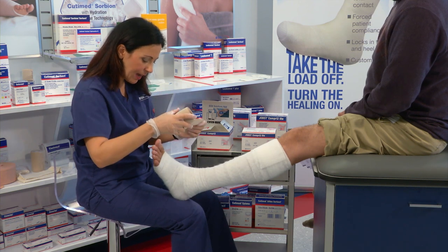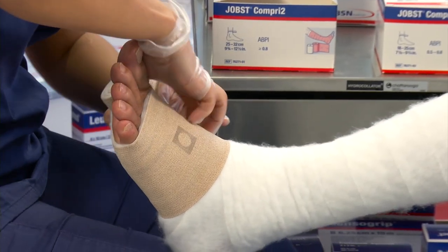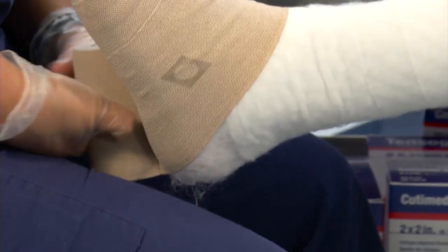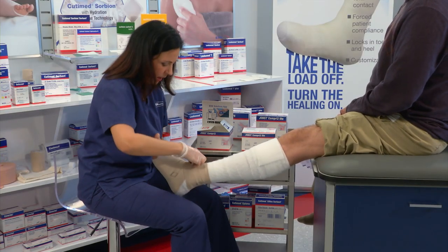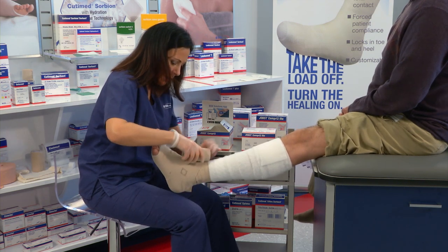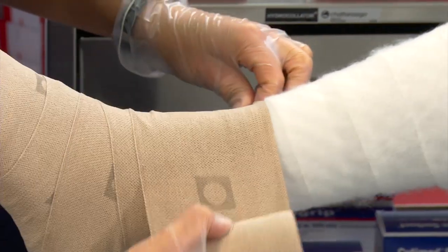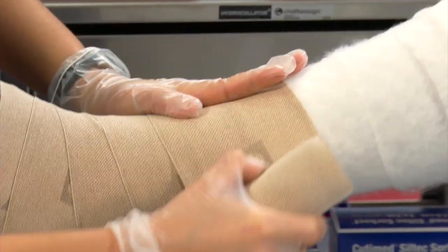We're going to apply this layer in the same fashion as we applied layer number one. We're going to start at the base of the toes and anchor twice around. When we get to the ankle, we're going to do a figure of eight and come back to make sure that we capture the heel. Then we're going to spiral up the leg in a 50% overlap. You can use your indicator also as a guide for your 50% overlap — when you cut the indicator in half, you know that you're getting 50% overlap of your bandage.